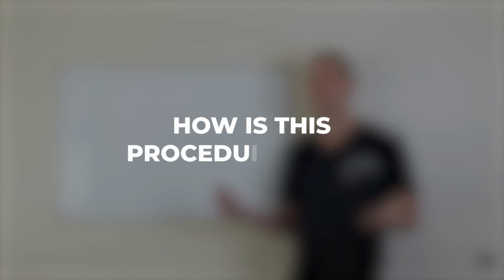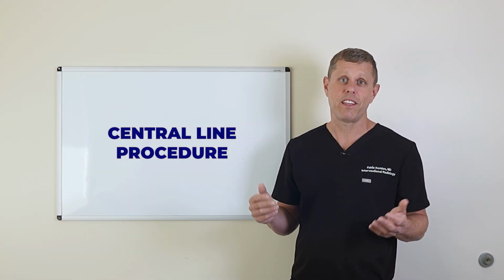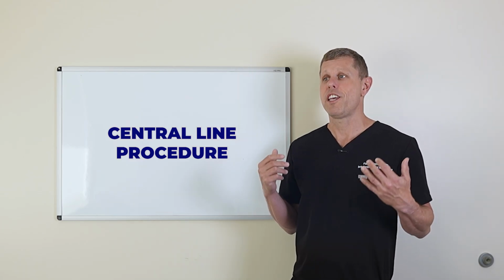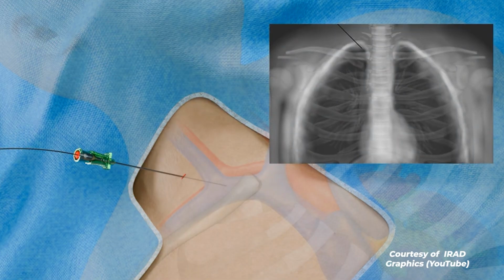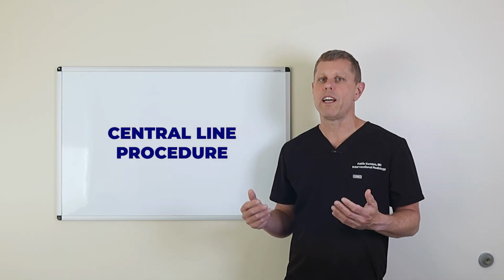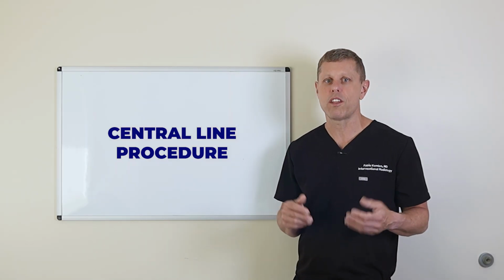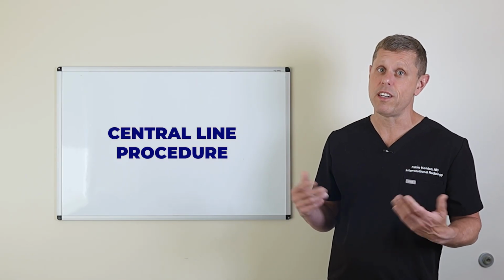So how are these procedures done? Most of these lines these days are placed by interventional radiologists, who are physicians that are highly trained and specialized in using imaging guidance like ultrasound and x-rays to place these devices. Non-tunneled central lines are usually done at the bedside for very sick patients. PICC lines can also be placed at the bedside, and they're usually done by specialized nurses that are trained to do them.